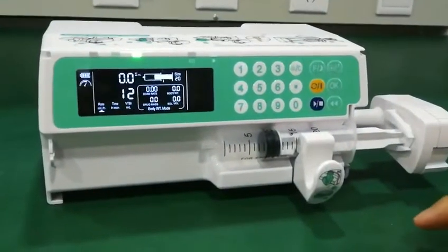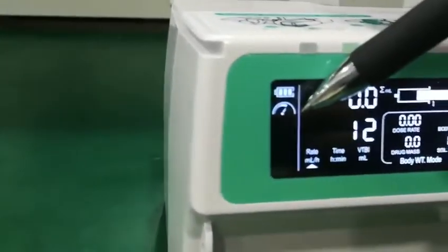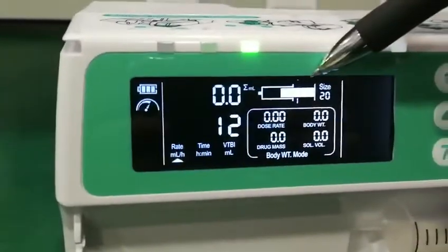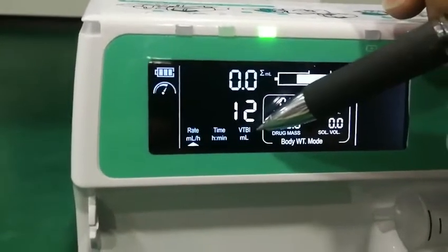Now I introduce the screen of the machine. Here is the occlusion level, here is the battery, here is the syringe size, here is the total volume infused, and here is the VTBI — volume to be infused.